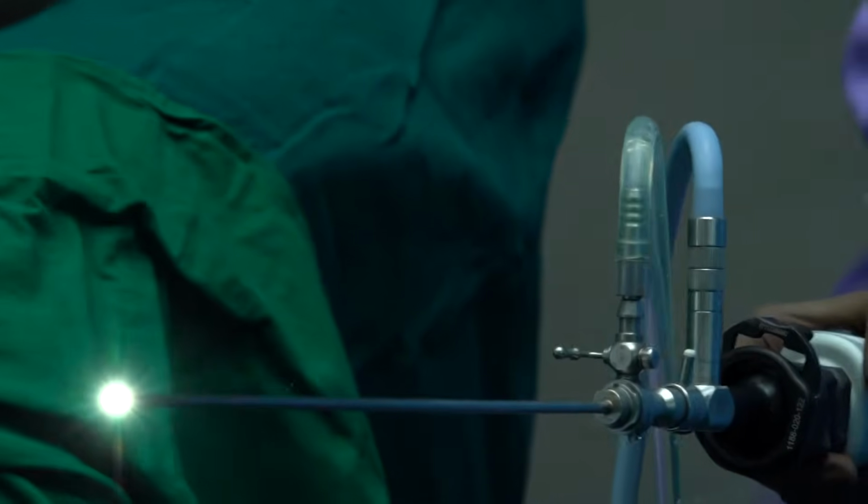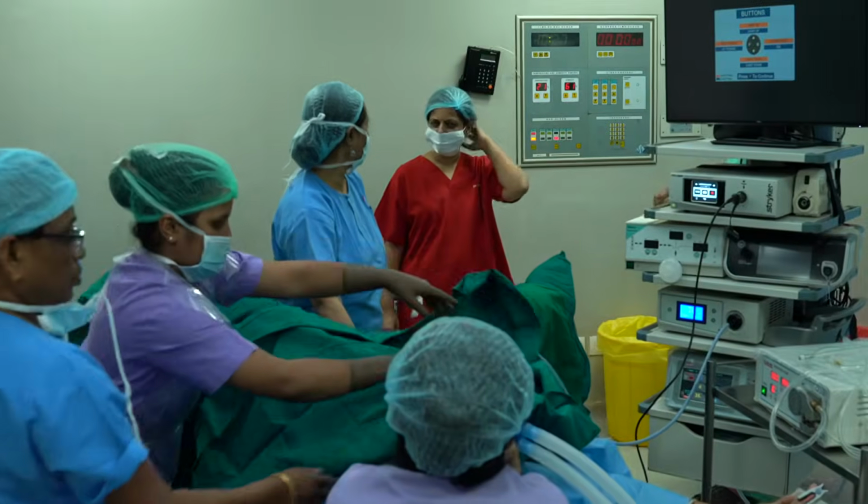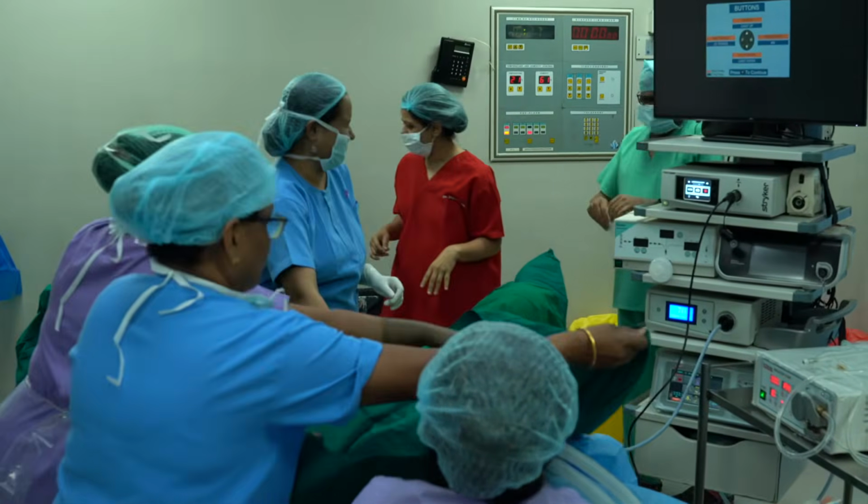This is diagnostic hysteroscopy. The patient is asked to report to the hospital 1 hour before the procedure. She is fasting for 6 to 8 hours. We are just getting ready here now.